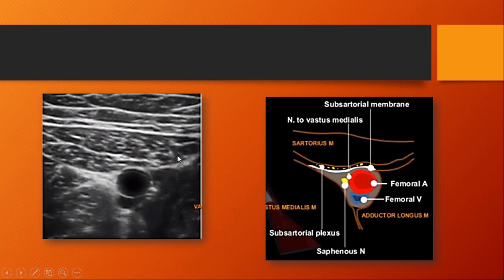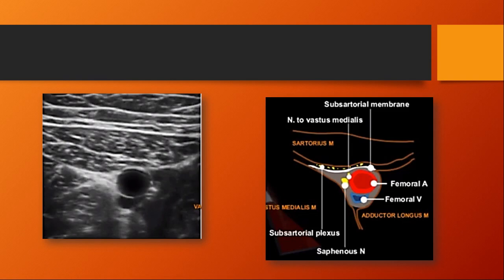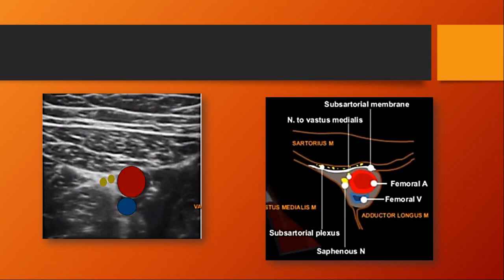On the ultrasound image, you find the sartorius muscle, adductor longus posteriorly, and vastus medialis laterally. Above the sub-sartorial membrane, you will find the sub-sartorial plexus. The femoral vein lies just behind the femoral artery. On the superolateral aspect, the two nerves — nerve to vastus medialis and saphenous nerve — are identified. If using peripheral nerve stimulation, stimulate the nerve to vastus medialis since the saphenous is purely sensory and cannot be stimulated.